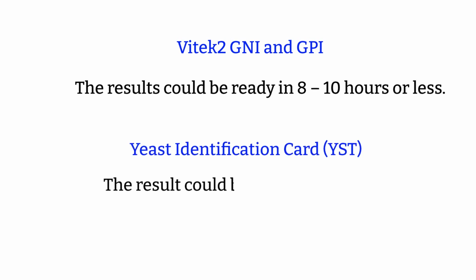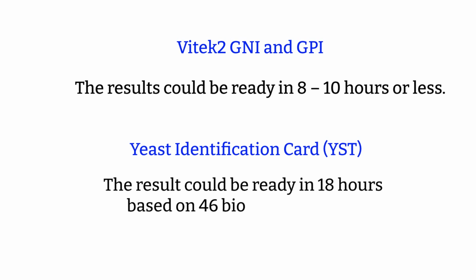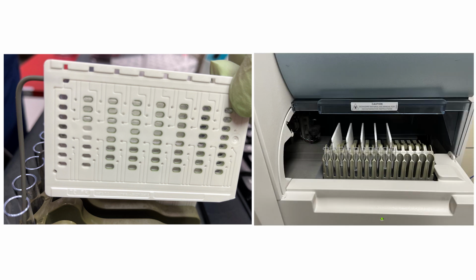However, the results for yeast would be ready in about 18 hours, based on 46 biochemical tests in the yeast identification card. Each card comes with little wells in it, and those wells have pre-embedded agents that react or perform the biochemical tests automatically.